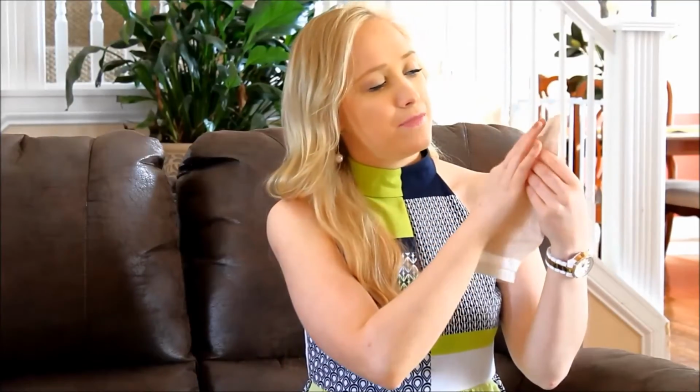The final step that I do, I just hold pressure right on the bag around this little ring for about 30 to 60 seconds. That really just makes sure you get a secure seal. It lets everything kind of set into place for a few seconds, and it really just makes me feel more secure, and I think it helps just to help everything set in there at the end, make sure everything gets on there good.